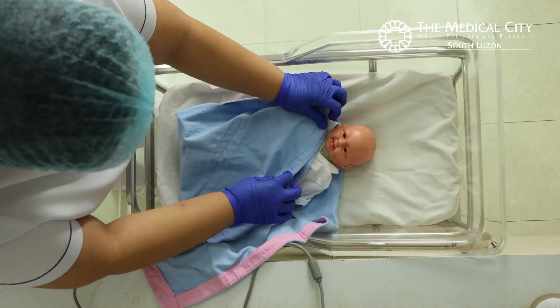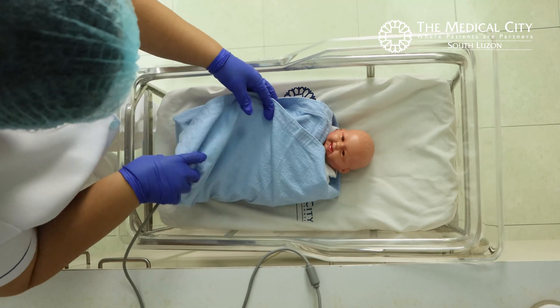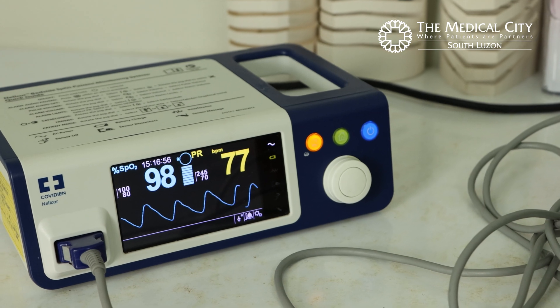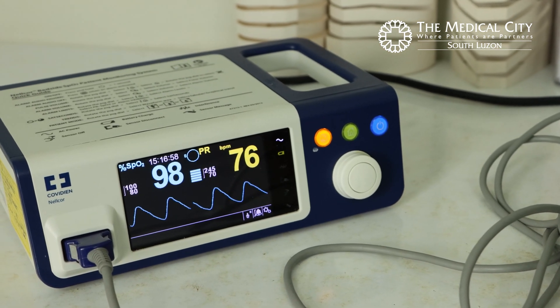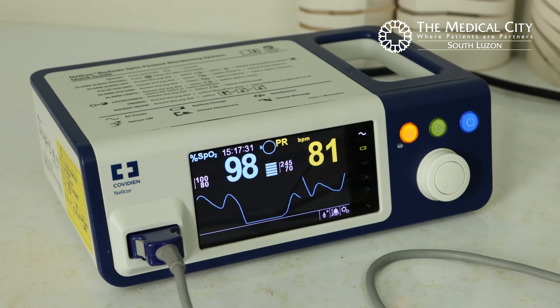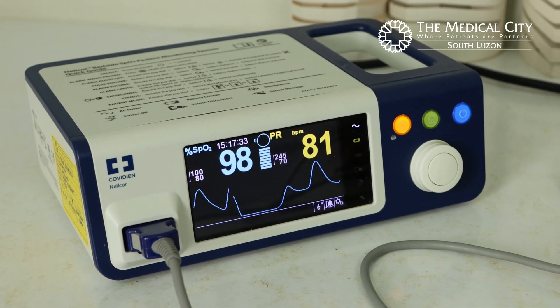Swaddle and calm the patient. Observe the oxygen saturation reading at the monitor. Make sure there is a pleth waveform that correlates with the patient's heart rate. These are the pre-ductal readings.